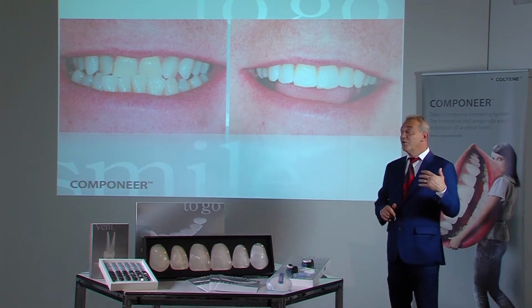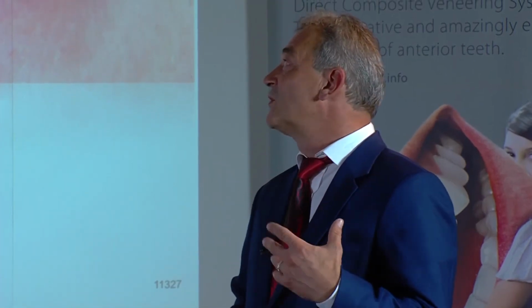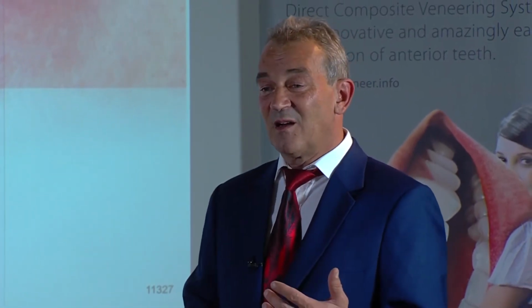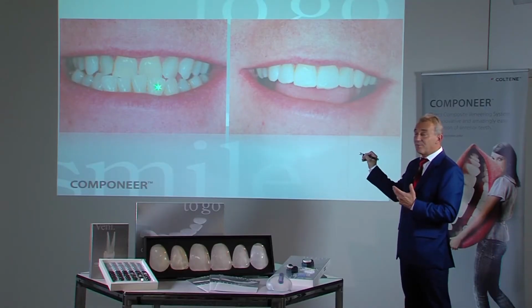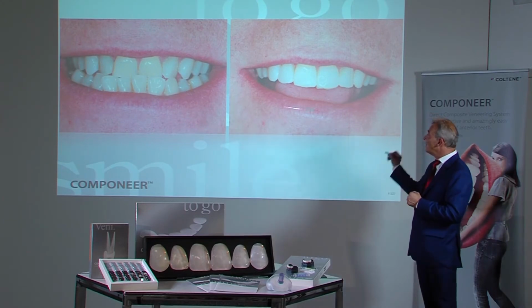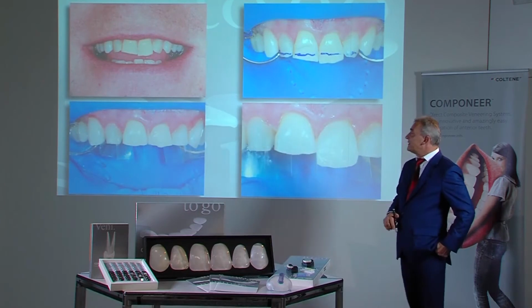This would represent an obstacle for normal reconstructions. Actually, one would have to say that this is not possible. But with a reconstruction using composite, one can say it is possible. However, one has to make concessions. It cannot be done without preparation of the teeth. Here we can view the diagnosis. The amount of grinding is determined.